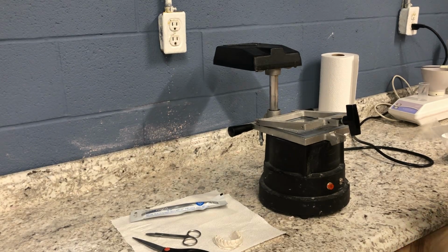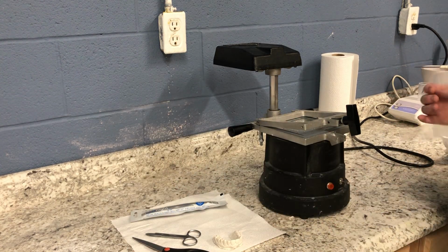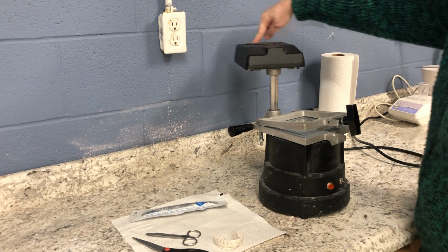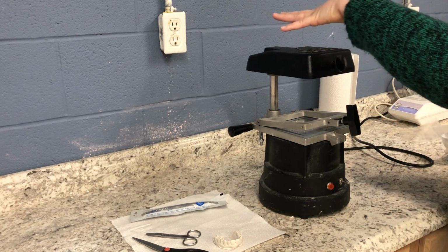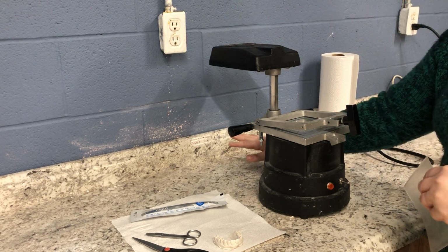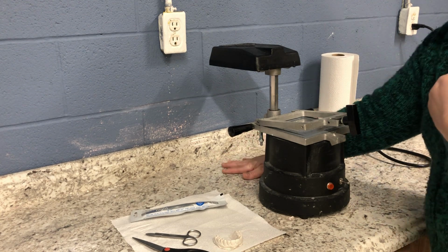Today we're going to make a bleaching tray, and I've got everything I need out here. How to operate this particular machine, you always want to hold it on this handle. It's very hot up here, so I'm going to turn it and face it back here. So anything you put underneath here can also get hot.